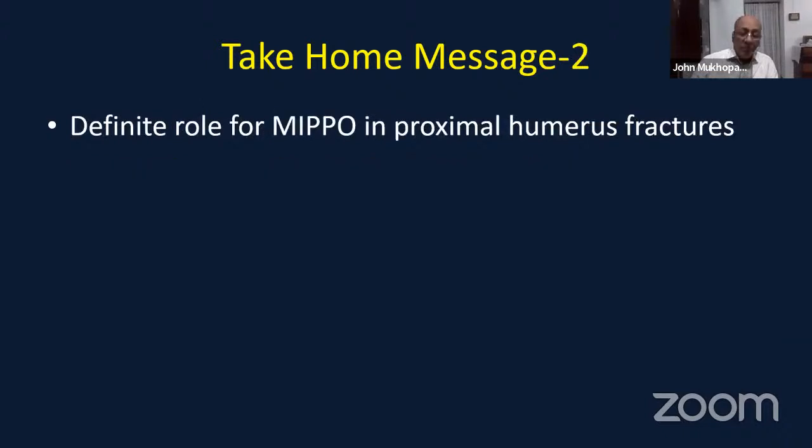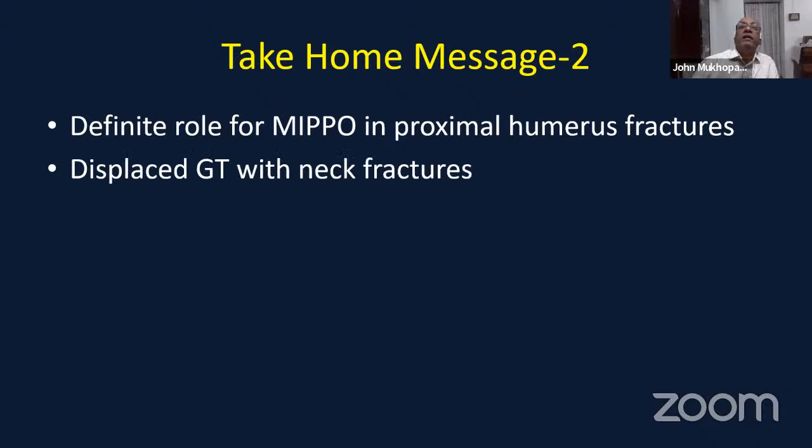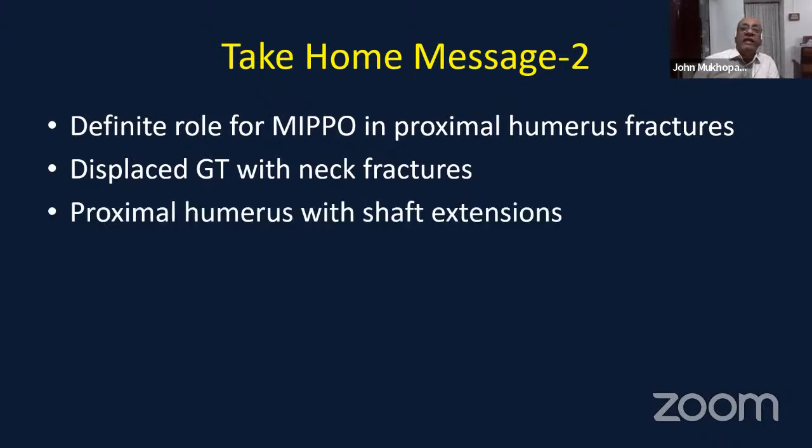And coming to the proximal humerus fractures, again, remember that there's a definite role for MIPPO in proximal humerus fractures. As I mentioned, the best indications are displaced tuberosity fractures with less displaced neck fractures. Conventionally, for really displaced three-part or four-part fractures, we are still using the lock plates. Occasionally, for displaced neck and three-part fractures, we've started using the nail. But for the four-part fractures and the very displaced three-part proximal neck fractures, we are still more comfortable with plating.